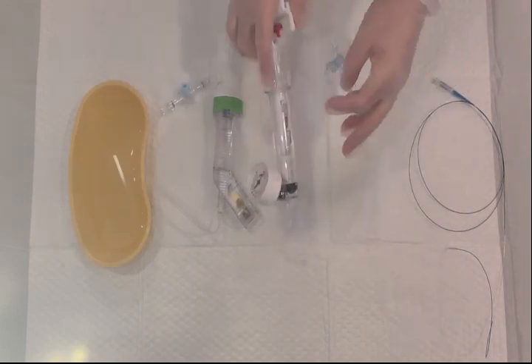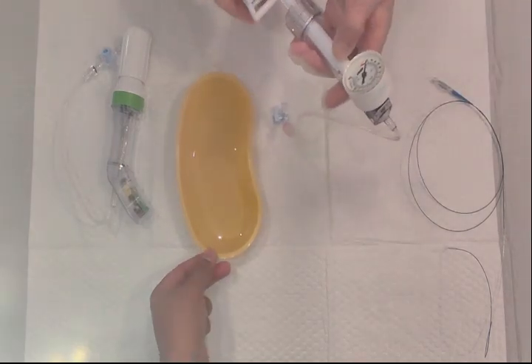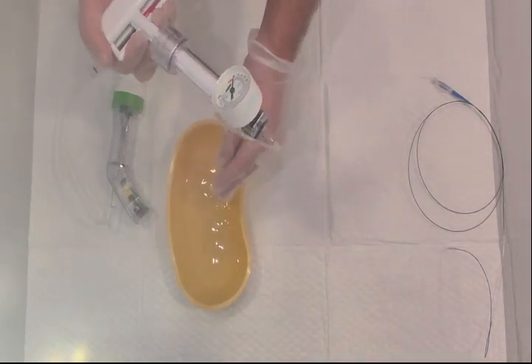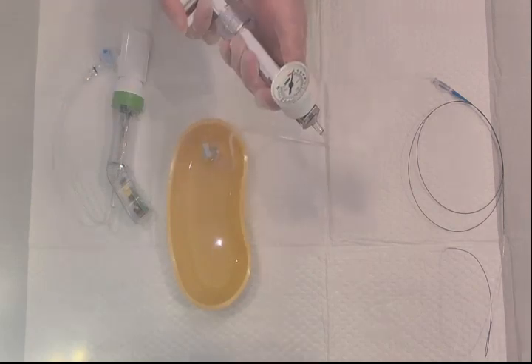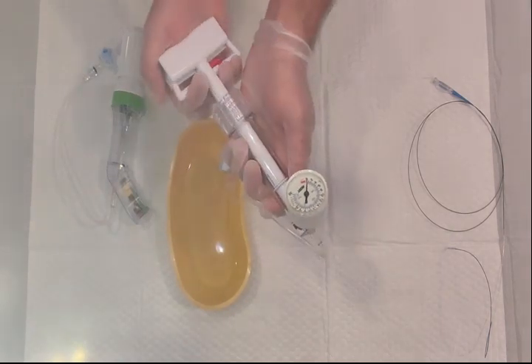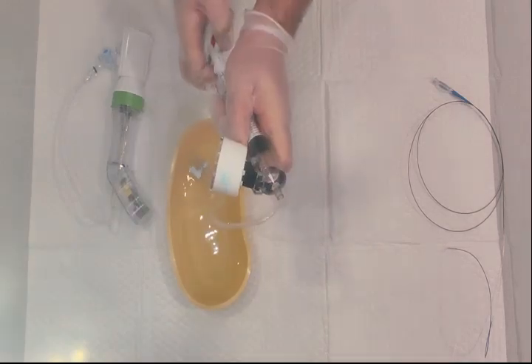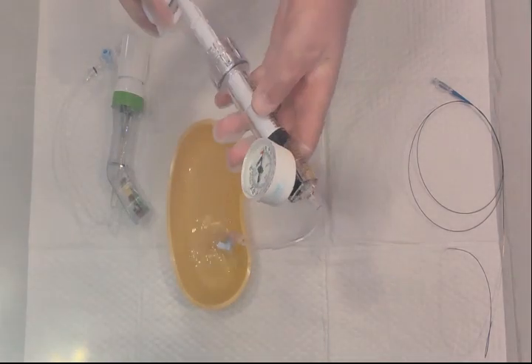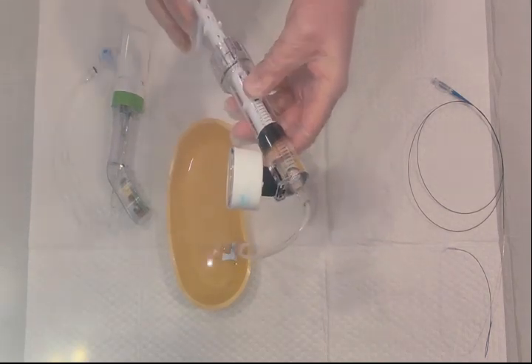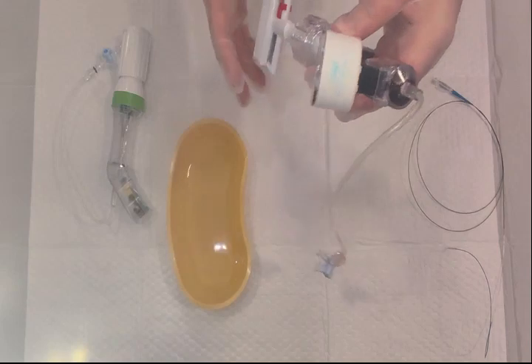Now let me show you how to fill this inflation device. In a real sterile procedure we would use contrast, but here we are using water for educational purposes. Press the lock to unlock and fill it air-free. Make sure not to take too much contrast into the inflation device itself, as that will cause difficulty in inflating the balloon or balloon stent.